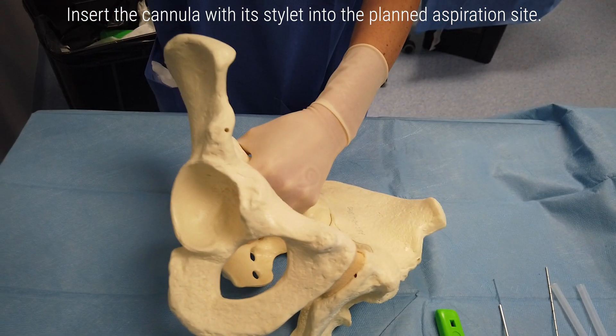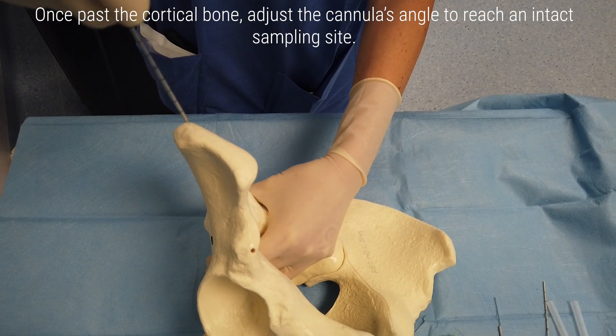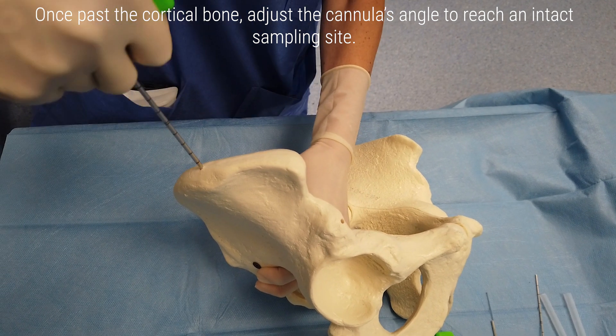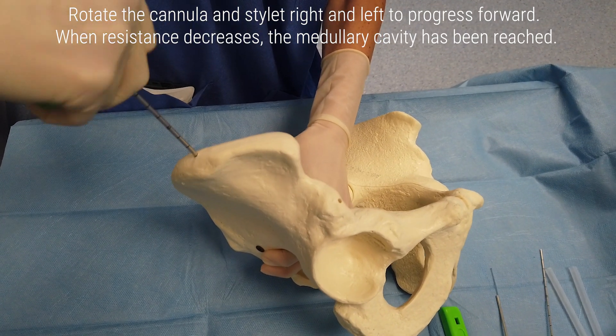Insert the cannula with its stylet into the planned aspiration site. Once past the cortical bone, adjust the cannula's angle to reach an intact sampling site. Rotate the cannula and stylet right and left to progress forward.